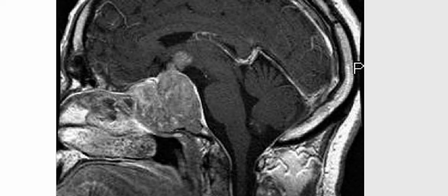This is a case of a 53-year-old man who presented with visual disturbances. On the contrast-enhanced sagittal T1-weighted MRI midline image through the brain, there is a large expansile enhancing soft tissue mass centered over the clivus with intracranial extension involving the sellar and suprasellar region. The pituitary gland was not identified separate from the mass. The key finding is a clival mass and the diagnosis is invasive pituitary macroadenoma.